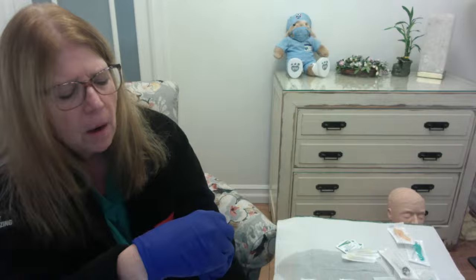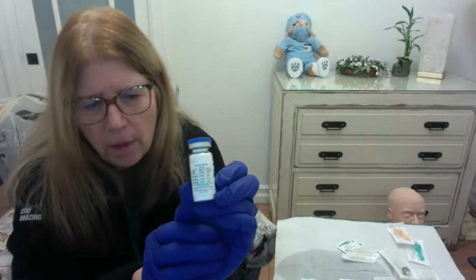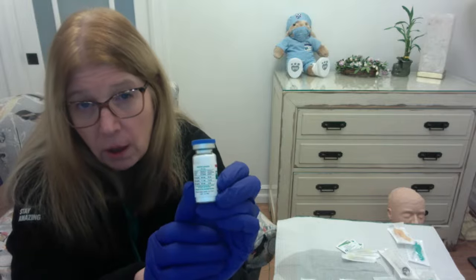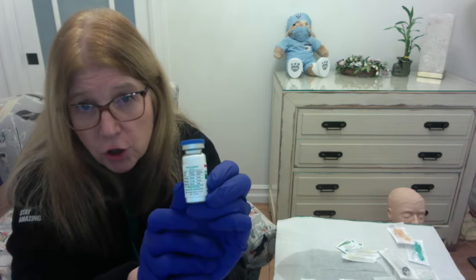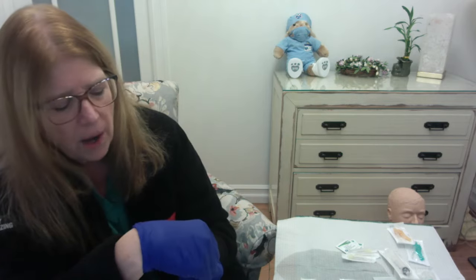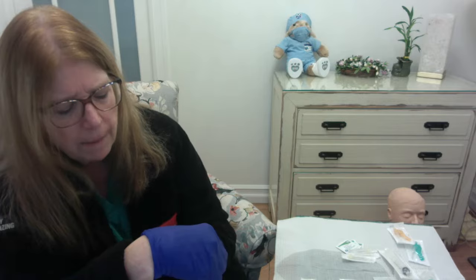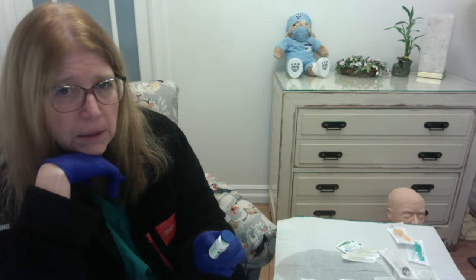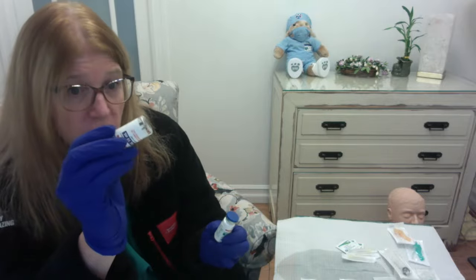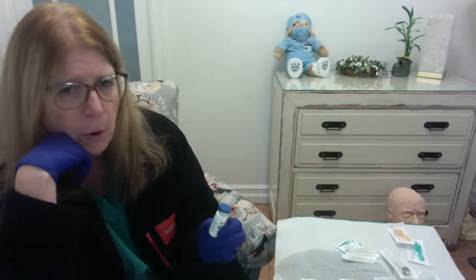vial. And on the side, there's going to be a little chart. And on that chart, it's going to tell you for however much fluid you put in here, you're going to get a different concentration of drug. So if I put in 6 milliliters of fluid, I'm going to end up with a concentration of drug of 500 milligrams per milliliter. If I put in 7.5 milliliters of my diluent, I'm going to end up with 400 milligrams per milliliter.